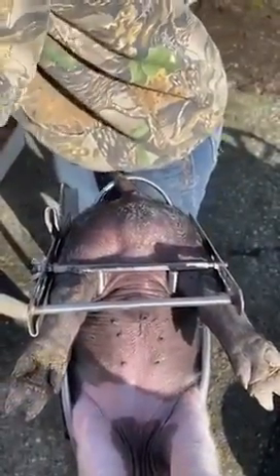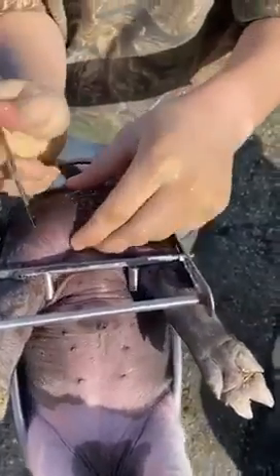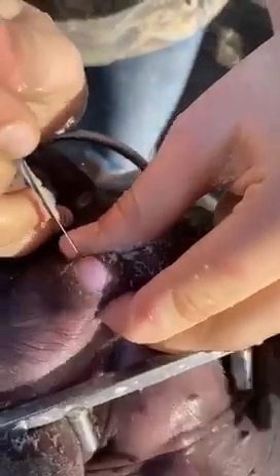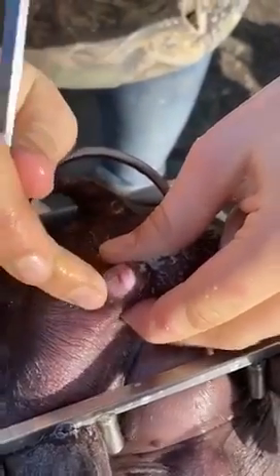We wash with iodine and then chlorhexidine, then use the scalpel through the skin. There's a little tiny thin membrane, and we just score that until it pops out.